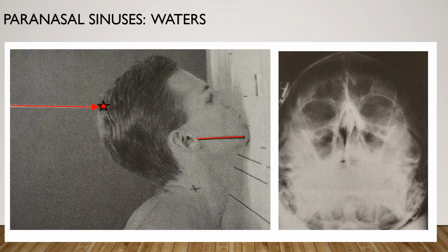When you look at the image, you're going to have an unobstructed view of the maxillary sinuses. Petrous ridges are going to be just inferior to the floor of the maxillary sinuses. Optimal density or brightness and contrast to visualize the paranasal sinuses. Sharp, bony margins with soft tissue detail and no motion.